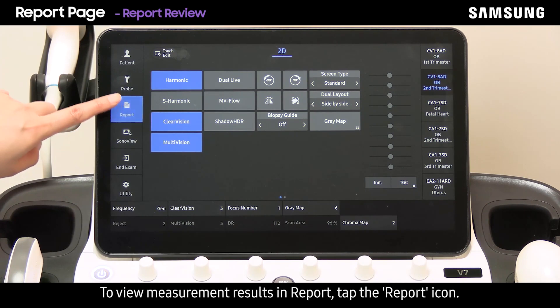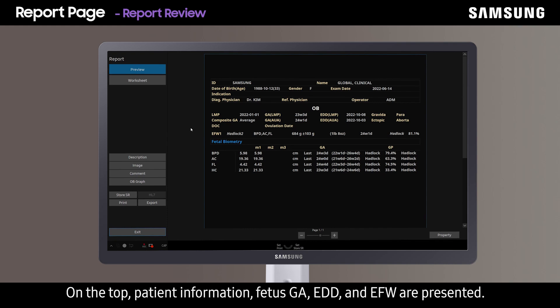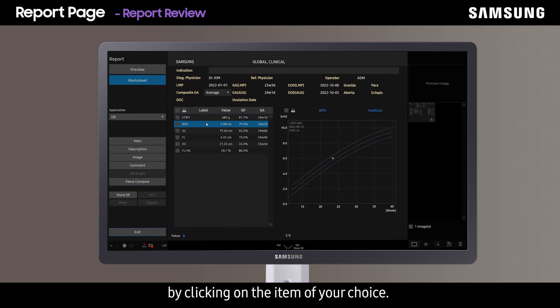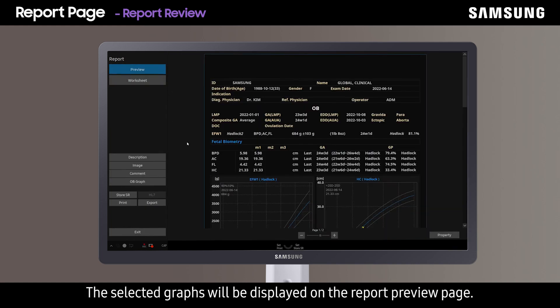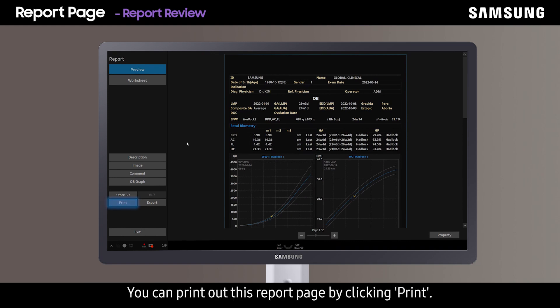To view measurement results and the report, tap the report icon. At the top, patient information, fetus GA, EDD, and EFW are presented. You can view results in graph form by clicking OB graph, and go over the graphs one at a time by clicking on the item of your choice. To insert certain graphs in the report, check the boxes next to the desired measurement items. To view the graphs before printing, press preview — the selected graphs will be displayed on the report preview page — then click print.